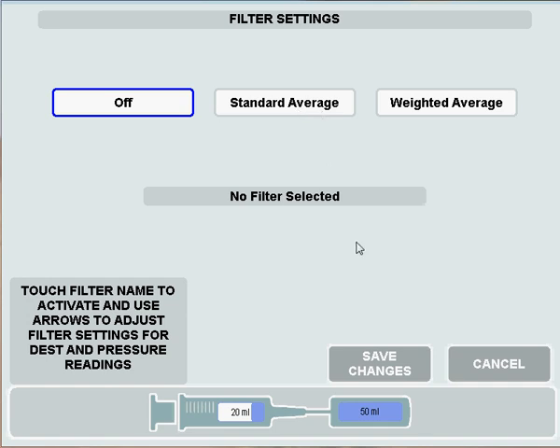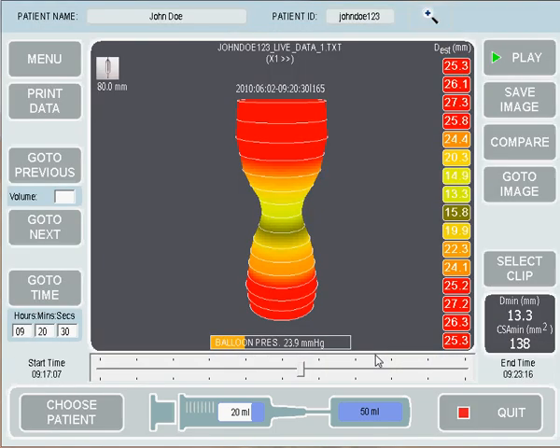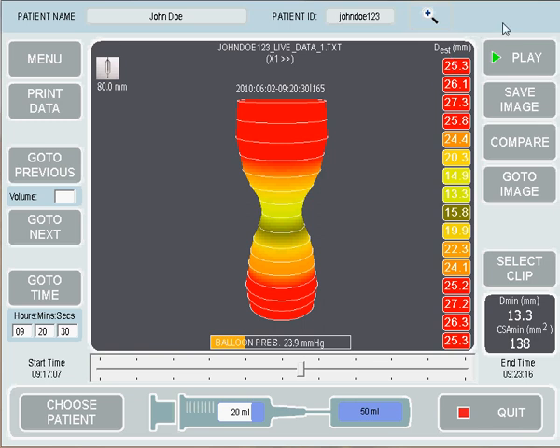After changing one of those settings — I've changed it to Off now — I'm going to press the Save Changes button to save that. You'll see the filter is off, so I no longer have my filtering icon. I'm going to replay the image from time 9:20:30, which you remember was nice and smooth — this is now without filtering.